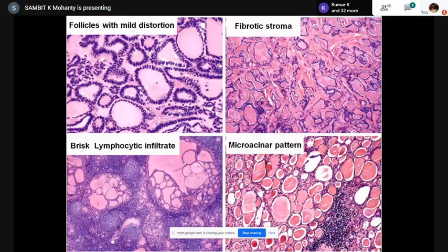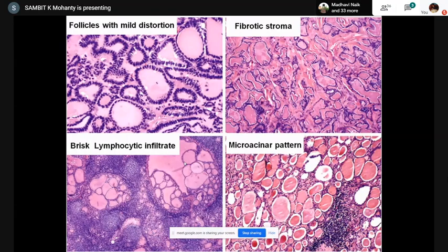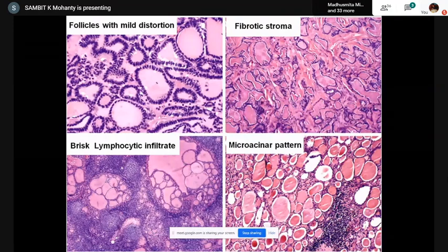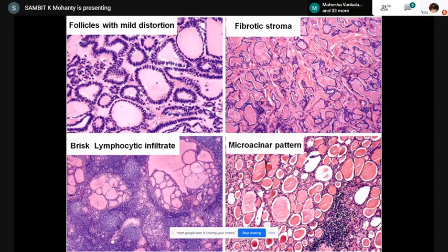On permanent section, we again had thyroid-like follicles with some architectural distortion, abortive papillae and infolding, areas resembling lymphocytic thyroiditis, follicle destruction, fibrosis. In the fibrotic areas the cells looked small with scant cytoplasm — atrophic — and there was fracturing and scalloping of the colloid.